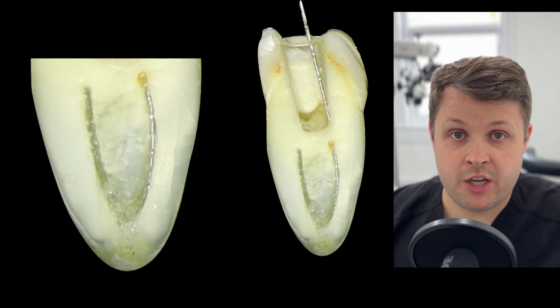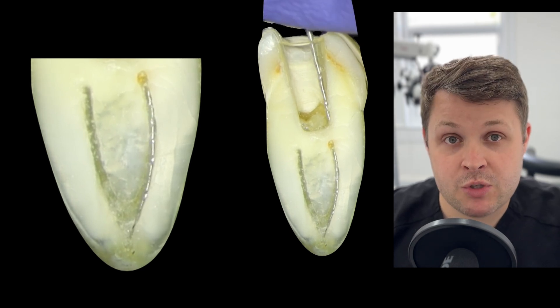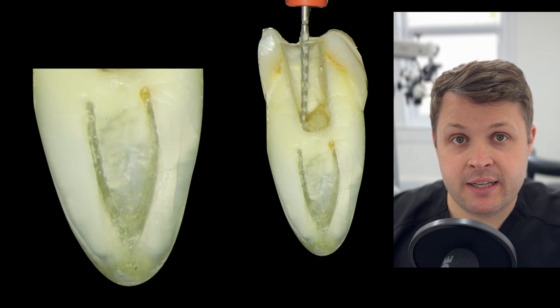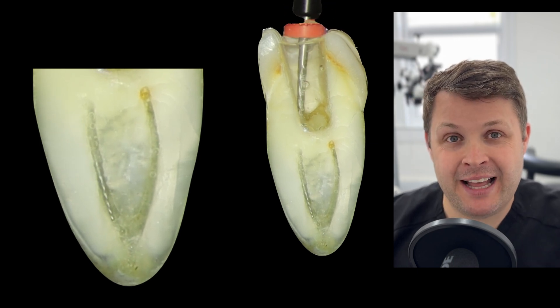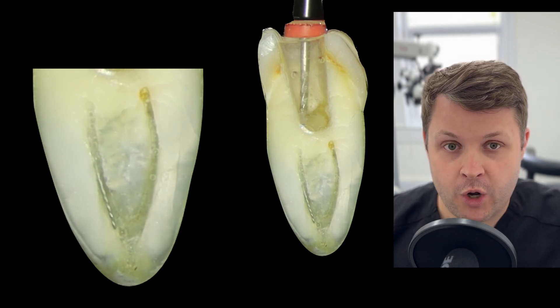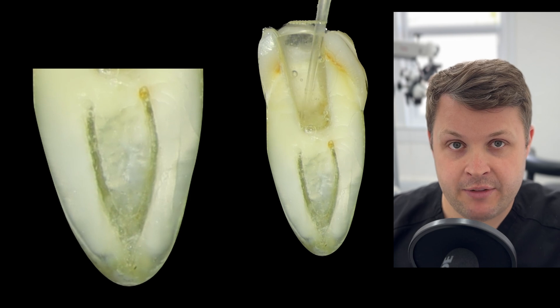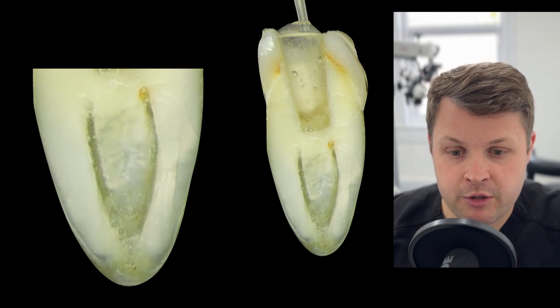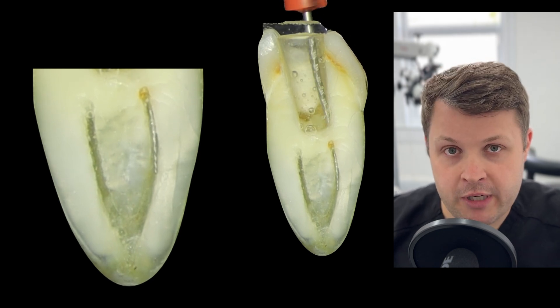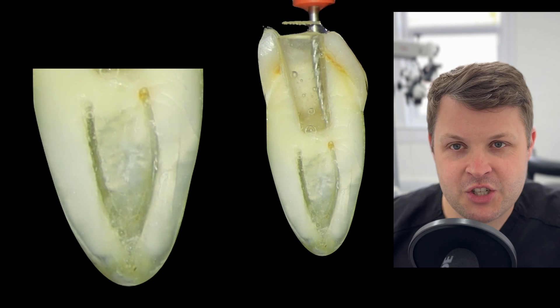We have to ask: is it stuck because of a ledge, calcification, or because the coronal third hasn't been shaped enough? We're going to use an orifice opener — in this case a mini cut Blackjack, a 1505 tapered file. It's short and the cutting efficiency is insane. These rotary files are just to open up the coronal third, running at 800 to 1000 rpm. These mini cut Blackjacks are by Plan B and work really well, including in MB2 canals.